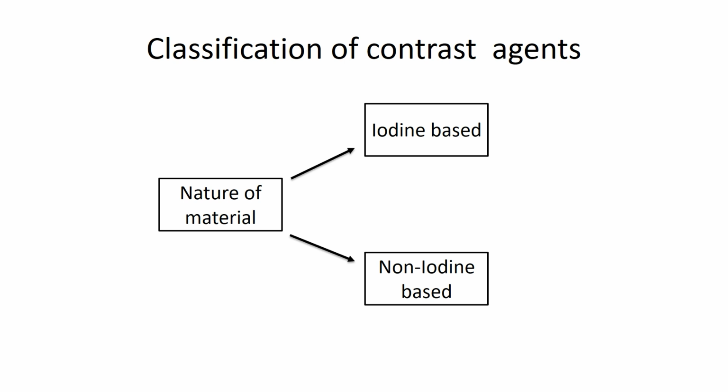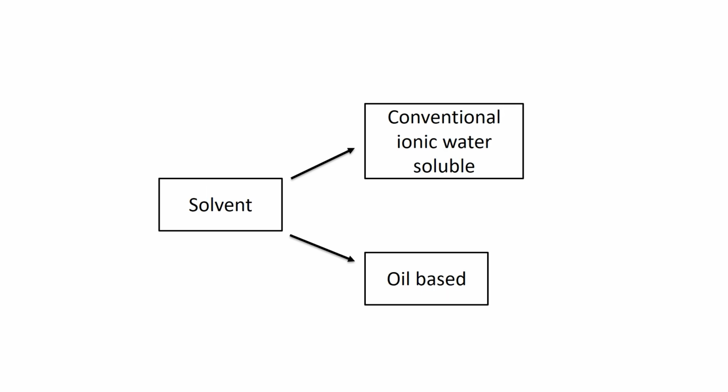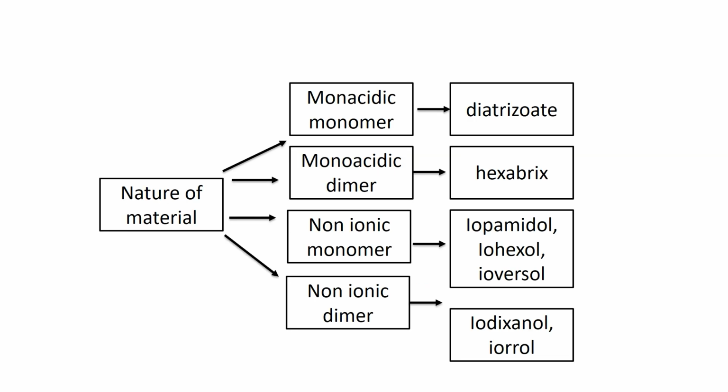If we have to classify the contrast agent based on the nature of material, we divide it into iodine-based or non-iodine-based. If we look at the iodine further, based on the solvent form, it could be divided into the conventional ionic water-soluble form or the oil-based.